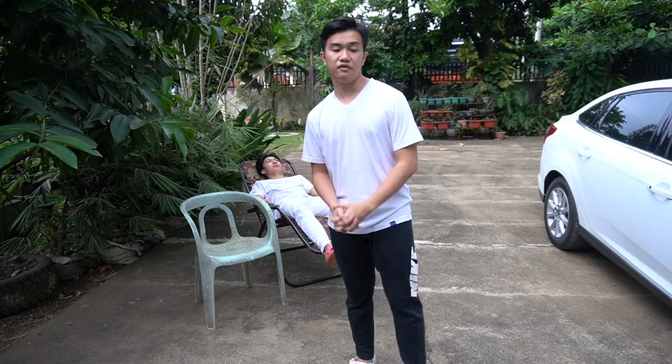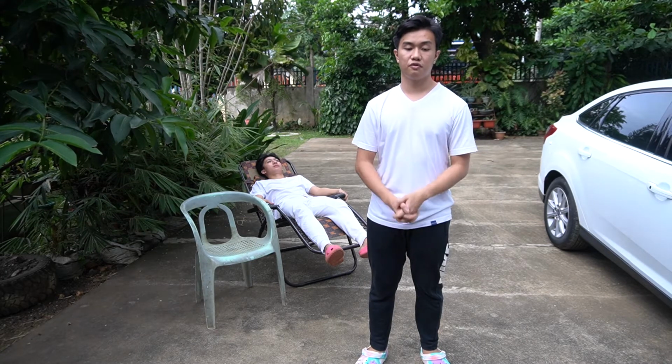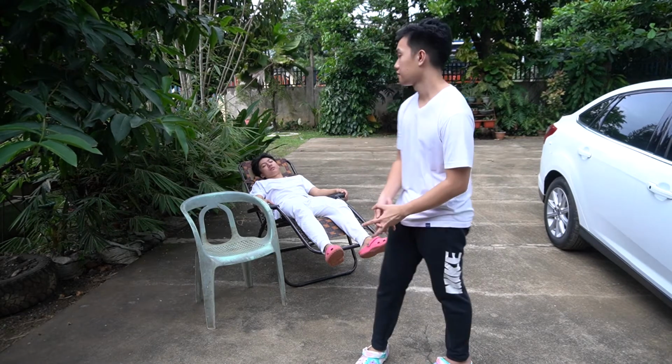Next, we are going to identify the patient and explain the procedure to the patient. Tell the patient to report any feelings of dizziness, weakness, or shortness of breath while walking. Decide how far to walk.